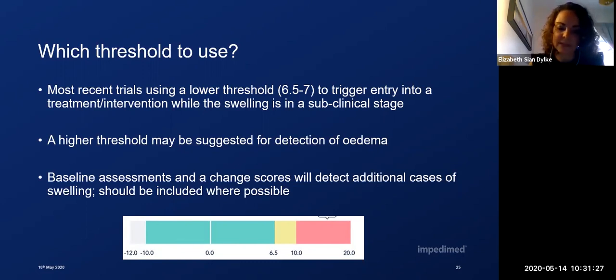However, there is growing evidence to support the use of a lower 2 standard deviation threshold, particularly during screening programs for lymphedema to trigger early intervention management options. To diagnose someone with lymphedema, a higher threshold may be more appropriate, but we should consider the caveat from the original study that 2 elevated measurements are required before they are considered a positive case.